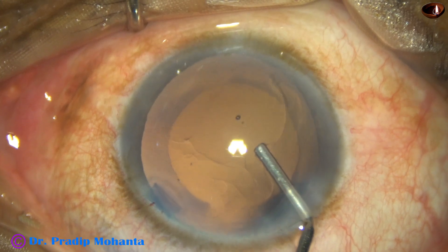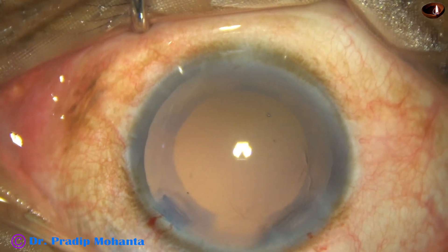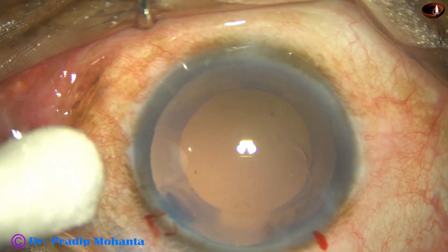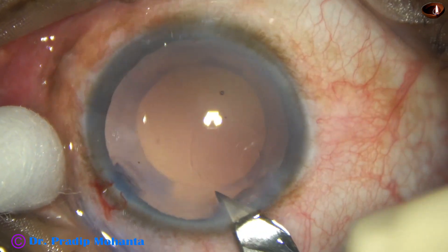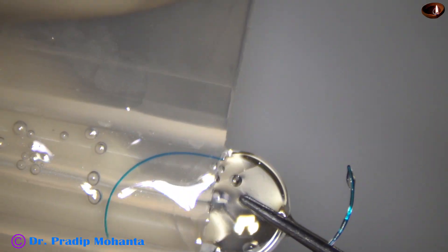The anterior chamber and the capsular bag are filled with 2% HPMC. In this case, I have selected a sensor multipiece intraocular lens, because if posterior capsular rupture occurs, the same lens can be placed in the sulcus.